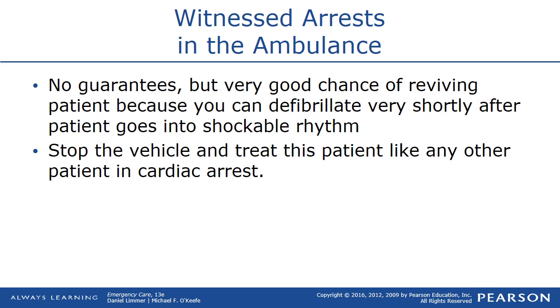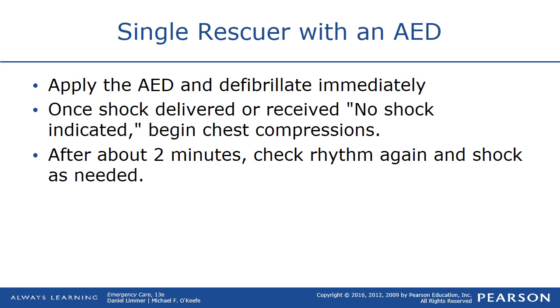Stop the vehicle and treat this patient like any other patient in cardiac arrest. Single rescuer with an AED: apply the AED and defibrillate immediately. The defibrillation is so important. Once the shock is delivered, or if you got a no shock indicated, begin chest compressions. After about 2 minutes, check the rhythm again and shock if needed.